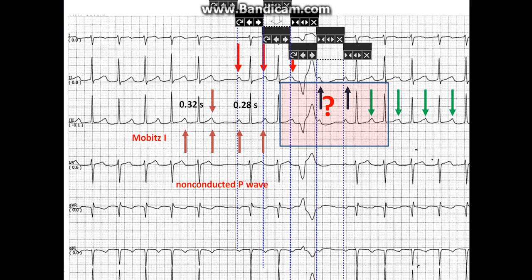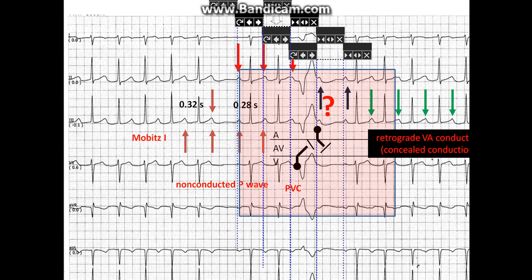Next, what is happening here? The wide QRS complex is a premature ventricular complex, or PVC. The P wave after the PVC is not conducted because of retrograde ventriculo-atrial (VA) conduction. This retrograde VA conduction is termed concealed conduction because it cannot be seen on the surface EKG.